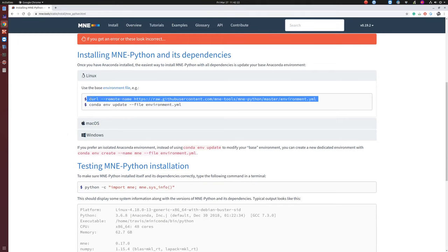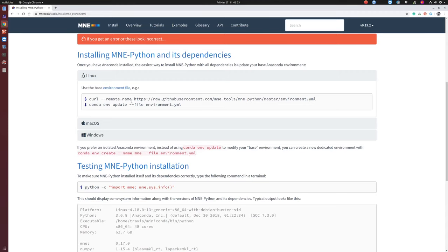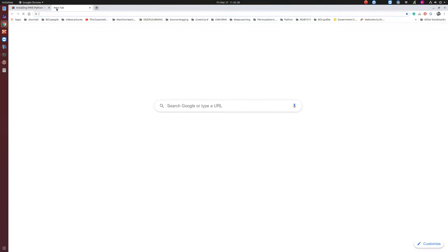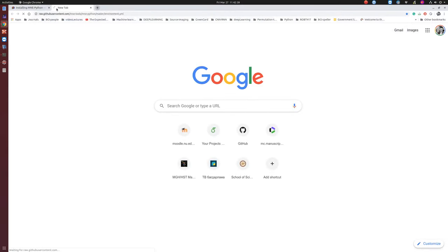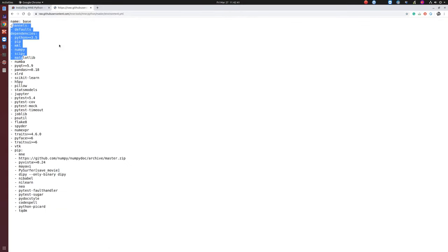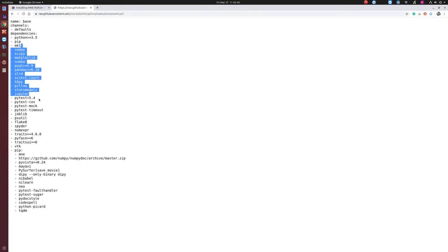You can also go to the install page and install the software depending on your operating system. For Linux users, you just run this command. It installs all the dependencies. You can also do pip install MNE.